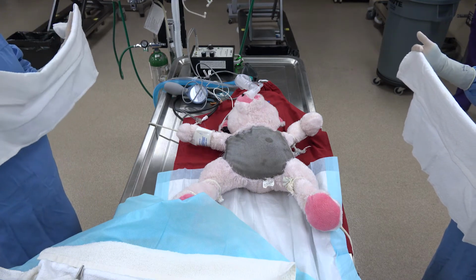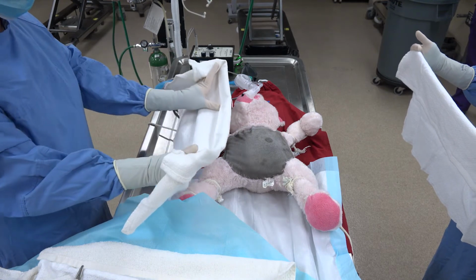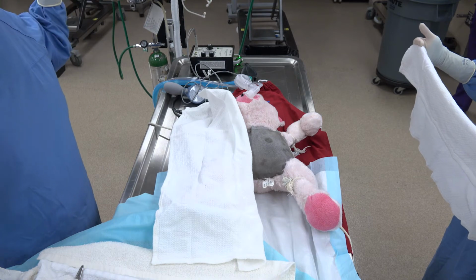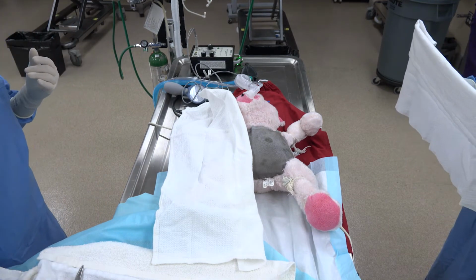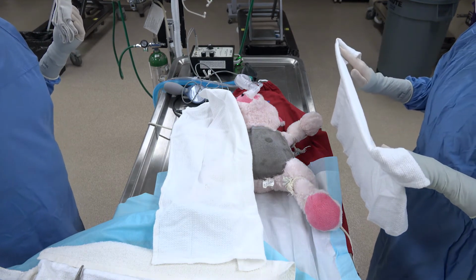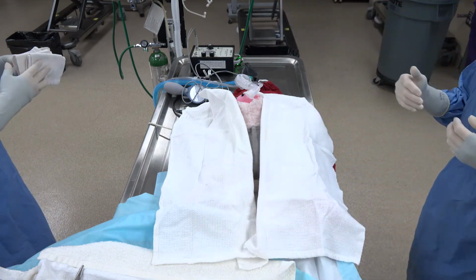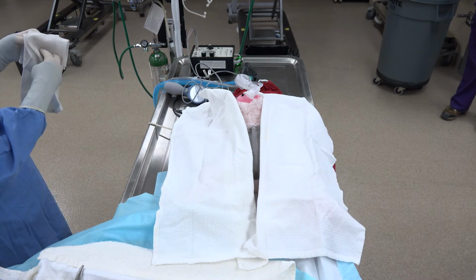All right, so then what I'm going to do is, of course, the perfect thing to do would be to have perfect aim like I have, and you just set it and lift your hands up as you go. All right, go ahead there, Sue. She's on the other side of the table. If I were by myself, because she was still scrubbing, I would have to walk around the table to do that side. Order of the towels does not technically matter.